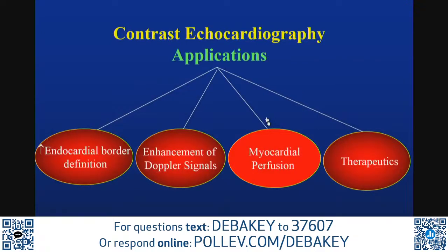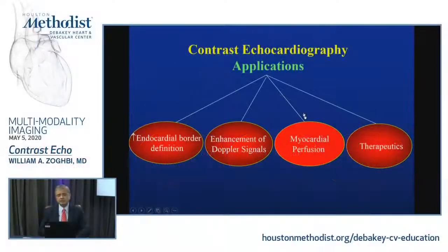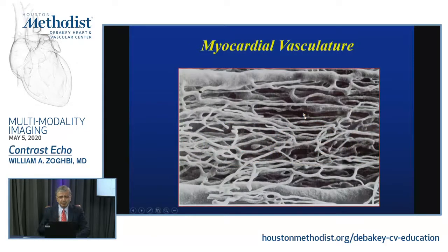And last, I think in the last few slides, we'll touch upon myocardial perfusion because it's interesting. People have done, and we have done, years of research in this area. We still have a modifier for CMS for billing, but to tell you the truth, we're not using this. We use a lot of research. It's great for research, but from a clinical point of view, it has some issues. But let's go through some principles.